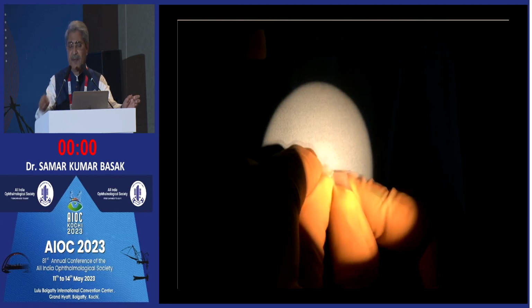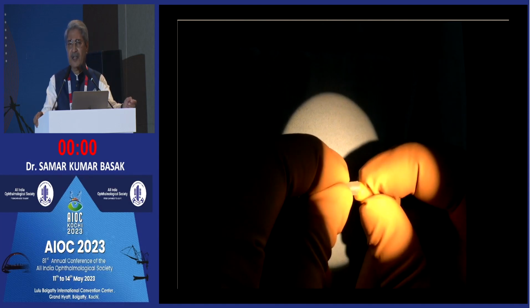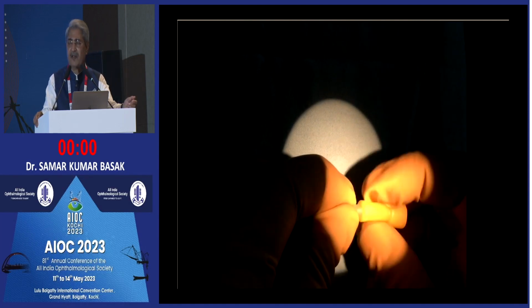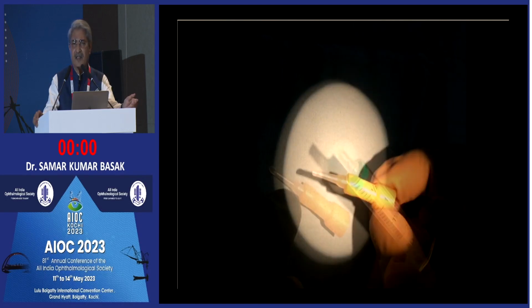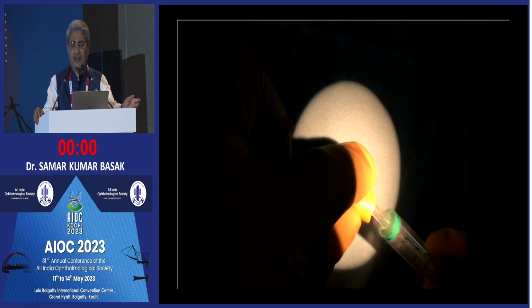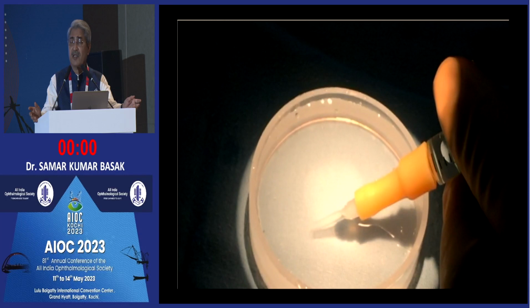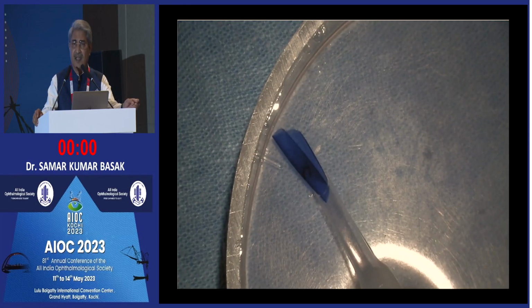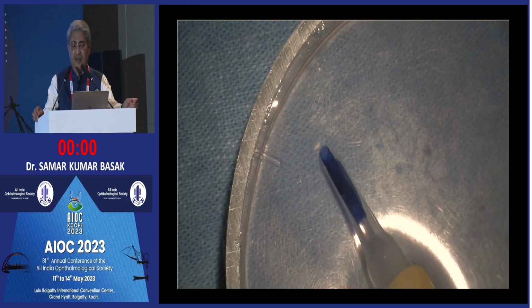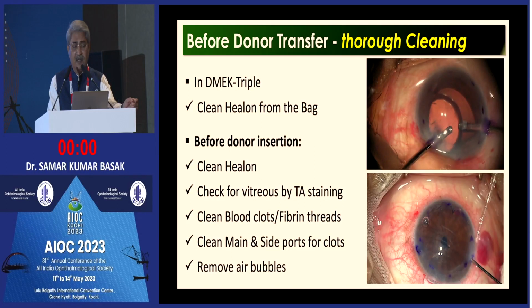But this preparation is very simple. You just make it. Every day you will have a new injector system in your hand, and every day it is free, and no need for sterilization, no need to autoclave, nothing. I prefer a 2cc syringe. This is BD, without any rubber inside. It should be smooth running. The syringe is also important, because that also causes a lot of trouble.